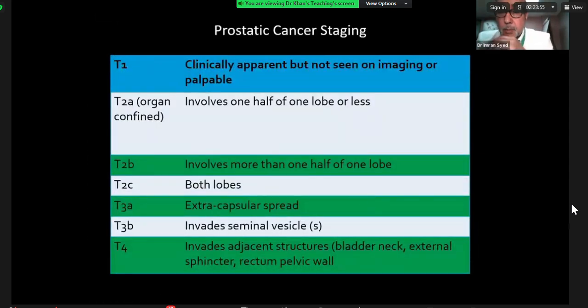And in terms of cancer imaging for the prostate, this I think is a really important slide, and I think we need to get a grip of this. For the exam, particularly at this level, T3 definition is very important, and you need to be able to define whether the disease has breached the capsule. But also the other feature that is important is the subdivisions of the T2.